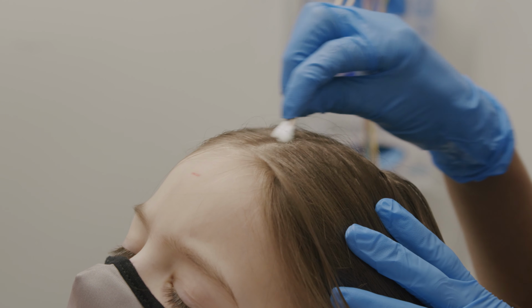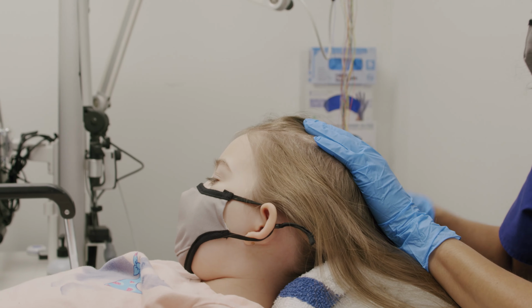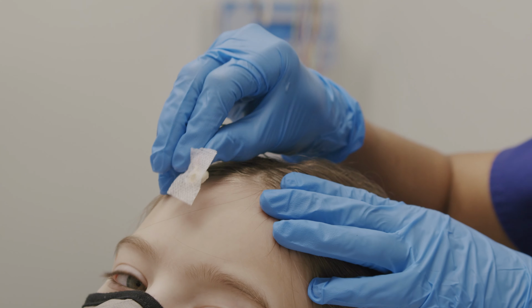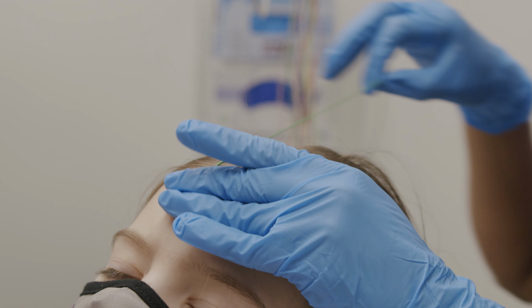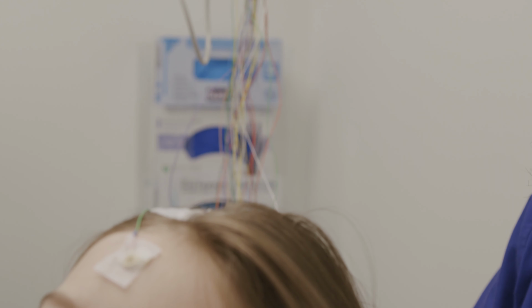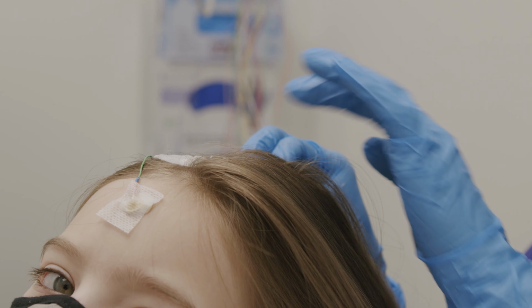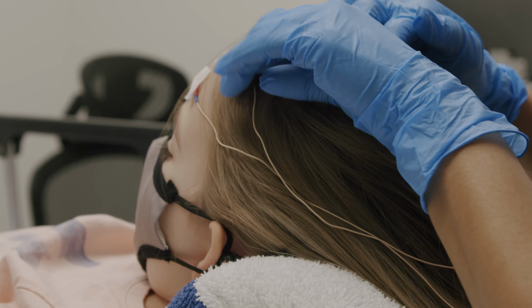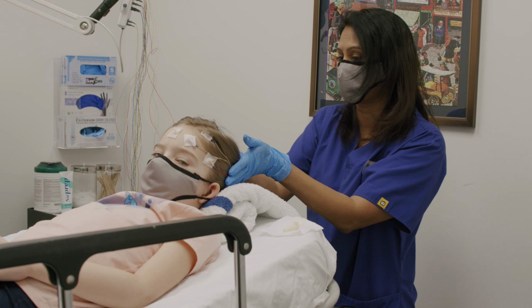There are a total of 23 electrodes that are applied to the scalp with conductive paste that records the brainwaves. During the recording, there are two activations, photic stimulation and hyperventilation, that are performed during the EEG. The recording will be a minimum of 20 minutes and can sometimes run as long as 60 minutes.